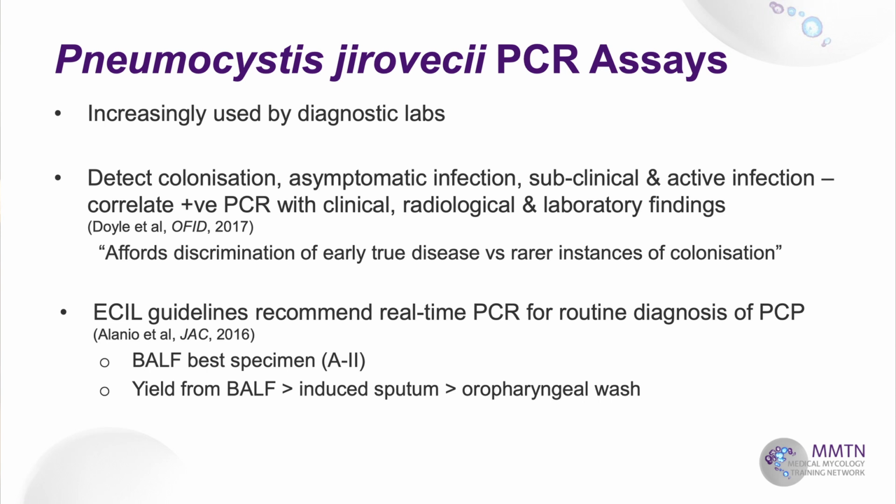It's the de-skilling of laboratory staff, and I guess the change in pneumocystis. In HIV, the load is much higher, whereas we see pneumocystis in our immunocompromised patients, and the load is much lower, so microscopy is not necessarily as sensitive. So we're increasingly seeing pneumocystis PCR being performed by many diagnostic laboratories.